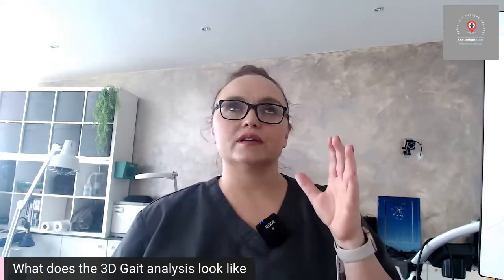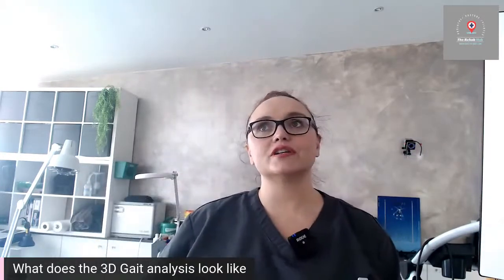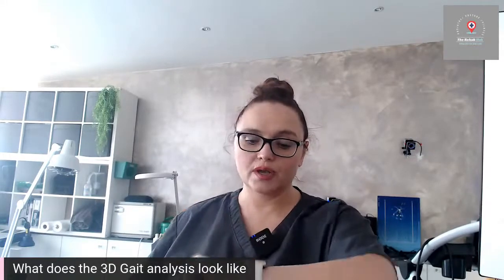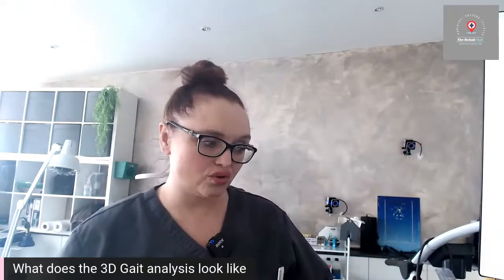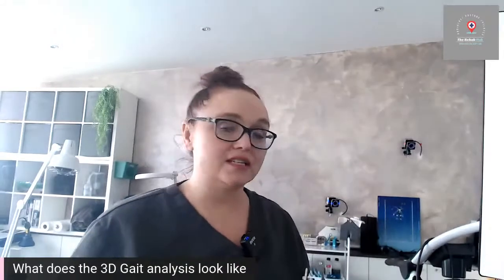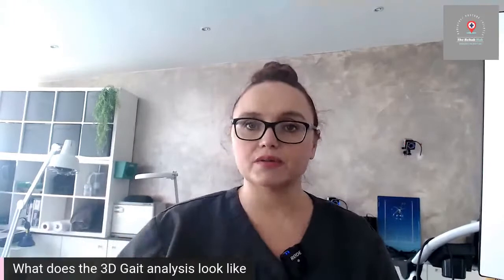We know how the body ideally should function. We know that we need about 65 degrees of dorsiflexion at your big toe. We're not going to just guess that you've got that, we're actually going to measure. We know that to ambulate properly, you need at least 15 degrees of dorsiflexion through your ankle joint. And if you don't have these kind of things, then something else has to pick up the slack.